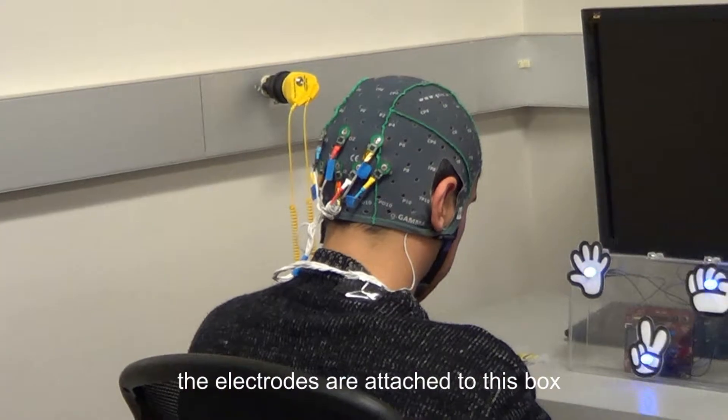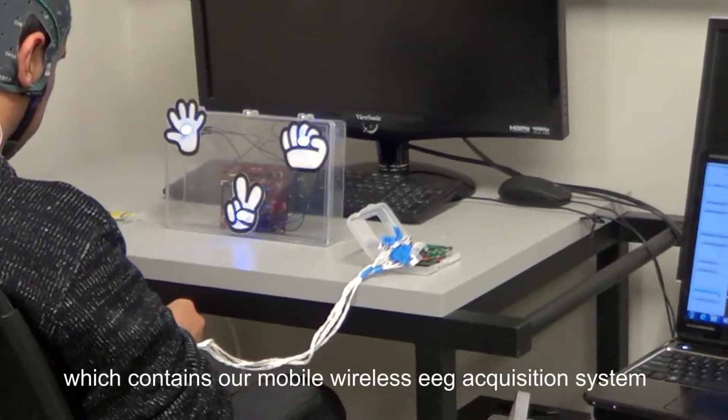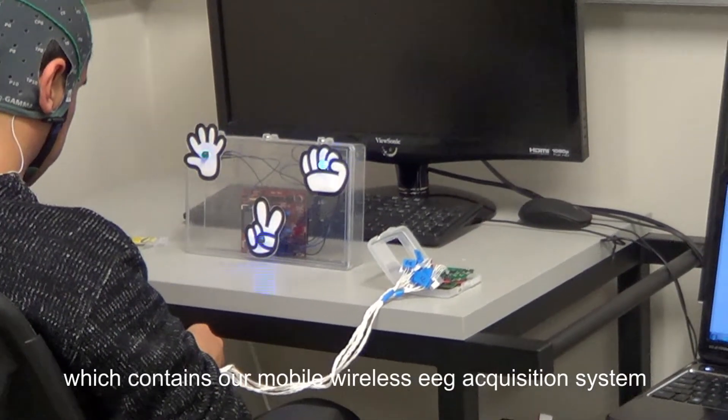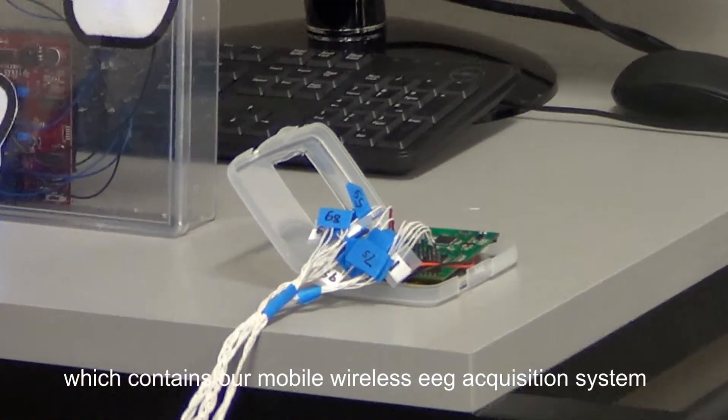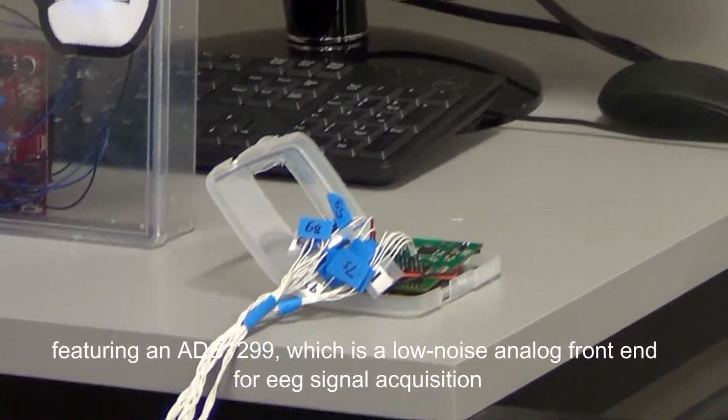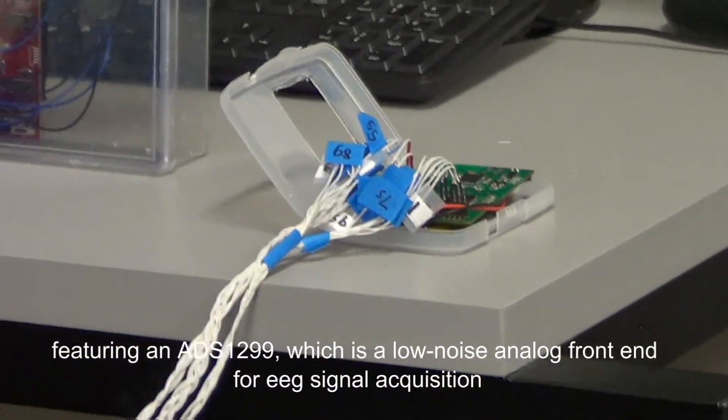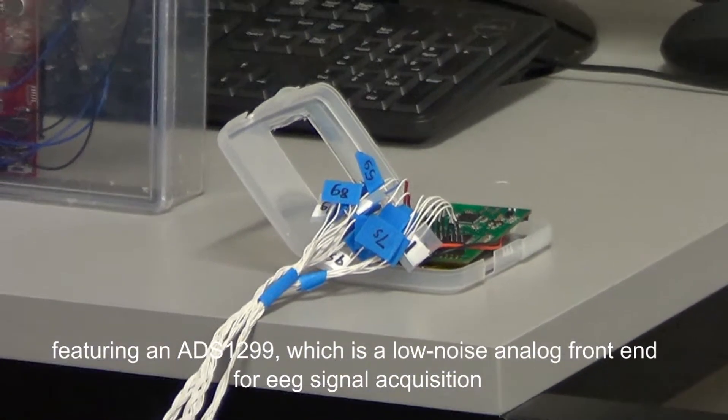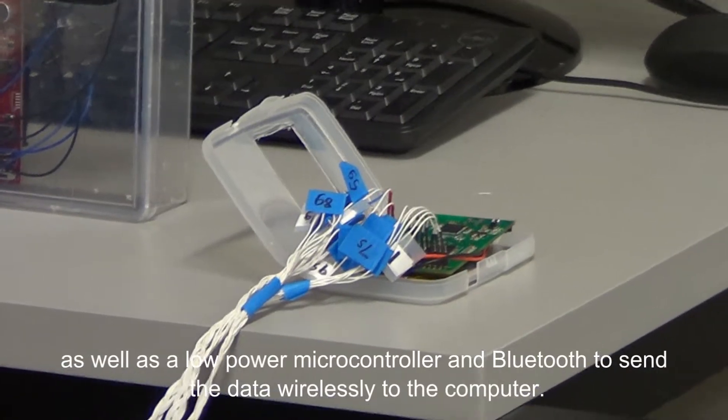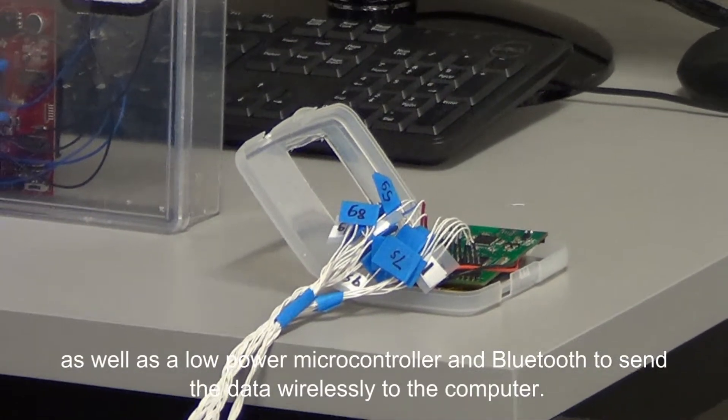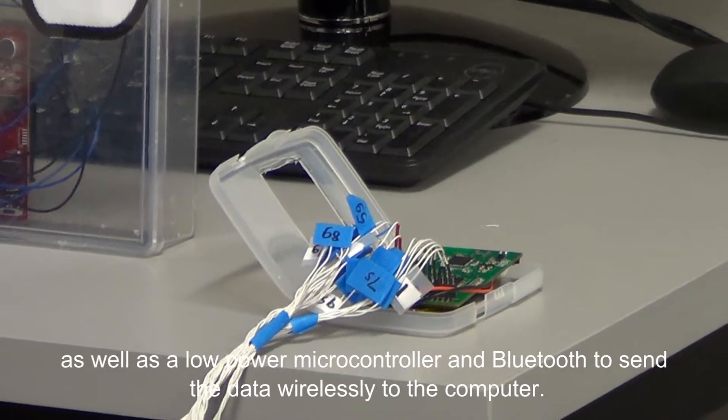The electrodes are attached to this box, which contains our mobile wireless EEG acquisition system, featuring an ADS1299, which is a low-noise analog front end for EEG signal acquisition, as well as a low-power microcontroller and Bluetooth to send the data wirelessly to the computer.